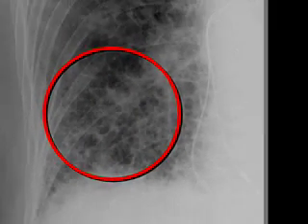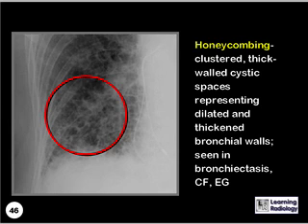What is the name given to this pattern? This is honeycombing, the cluster of thick-walled cystic spaces representing dilated and thickened bronchial walls. It can be seen in many diseases, including bronchiectasis, cystic fibrosis, and eosinophilic granuloma of lung.